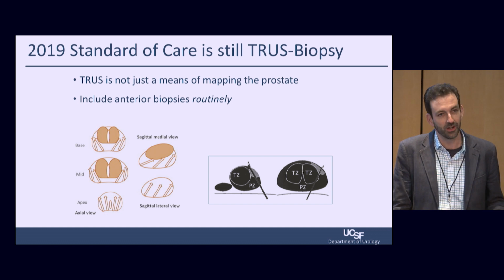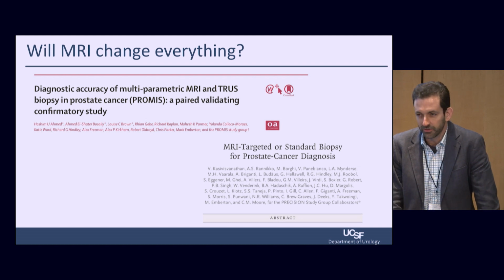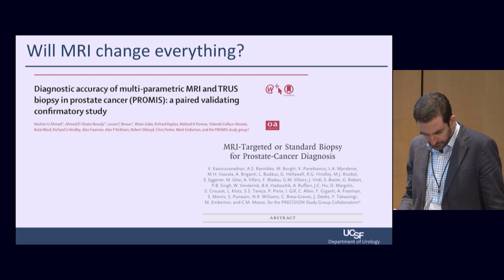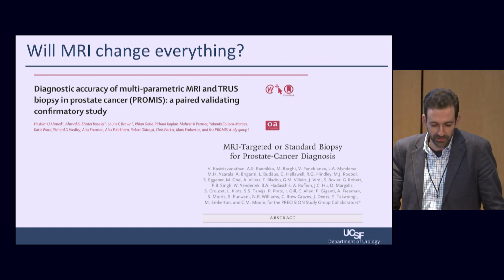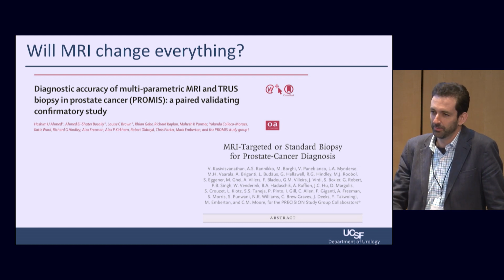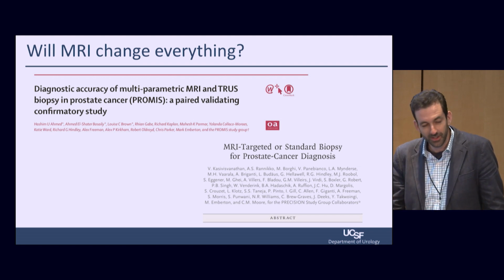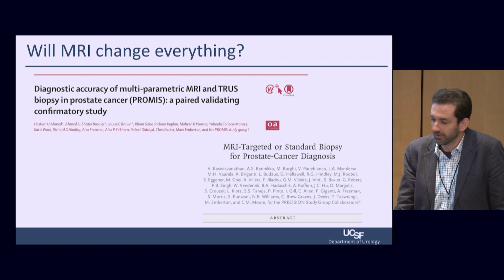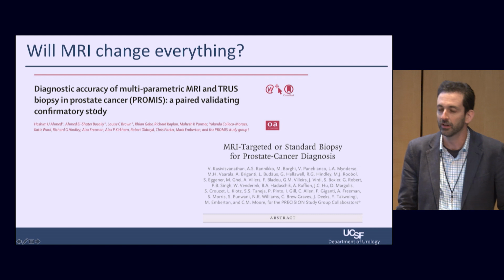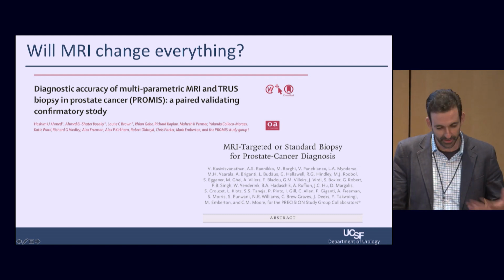And the better you do the ultrasound and the better you look at the TRUS, actually the lower the incremental value of the MRI. There's a couple big trials that came out really suggesting that MRI should play a role really early in workup of prostate cancer. These are both UK trials. Based on these, the UK is now putting in this protocol whereby if you have an elevated PSA, you get an MRI. If your MRI is clear, you don't get a biopsy. And I actually don't necessarily think the data are ready for that. The PROMISE trial, which had a better gold standard here, they missed about 25% of the high-grade cancers if they had not biopsied anybody with a negative MR.